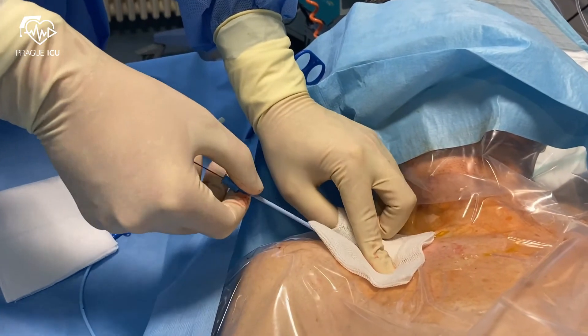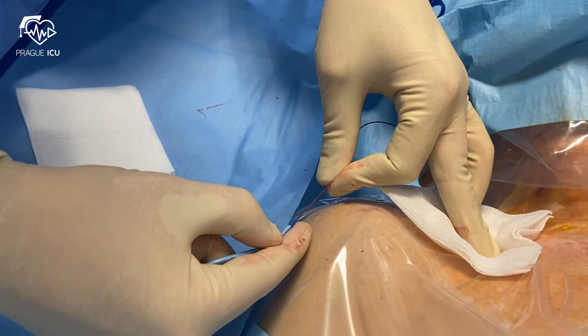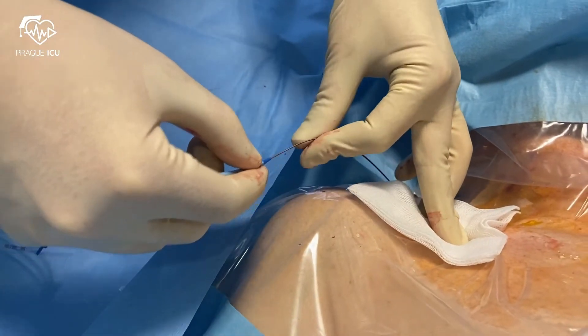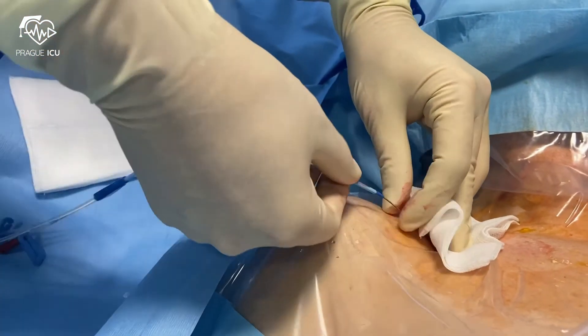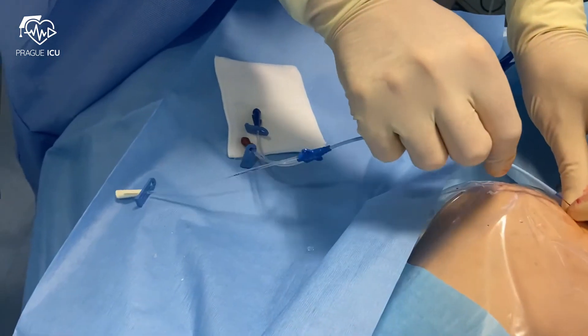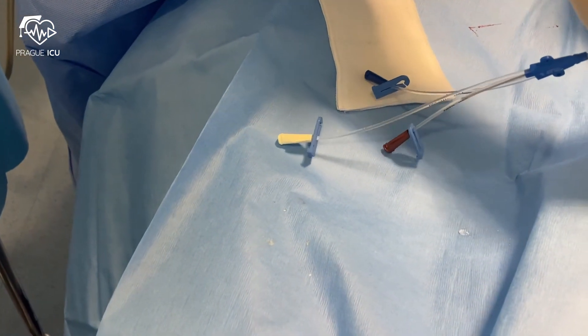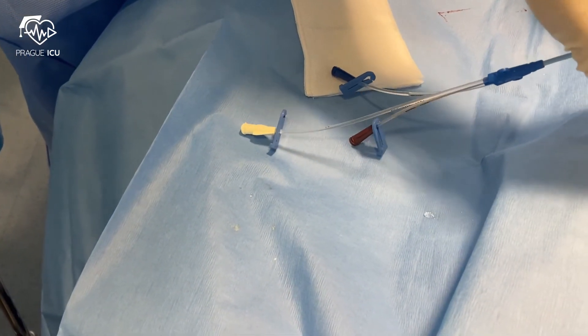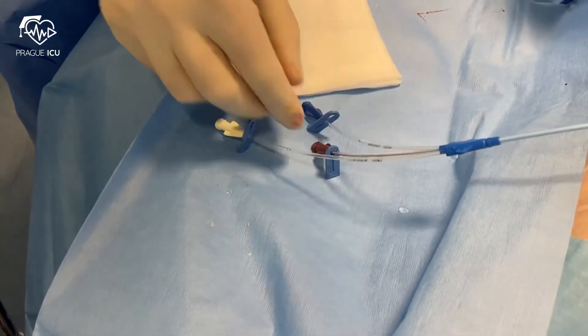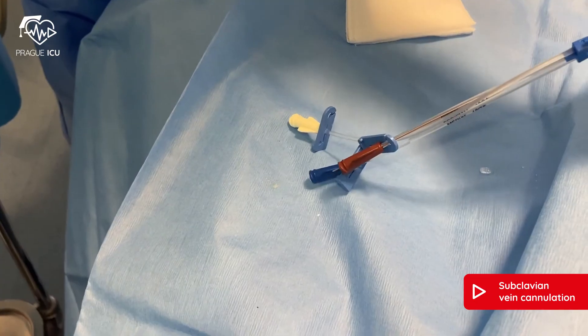Remove the dilator and anticipate bleeding — apply gauze pads to minimize it. Then advance the catheter, always inserting the line under the same axis as you inserted the dilator. Do not advance the line until you have hold of the end of the wire. Aspirate and flush all lumens appropriately and apply lumen caps.